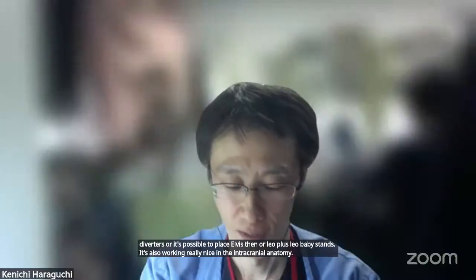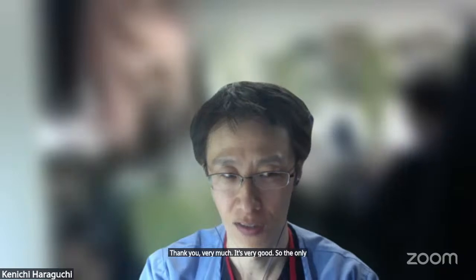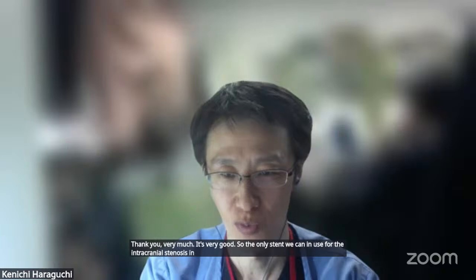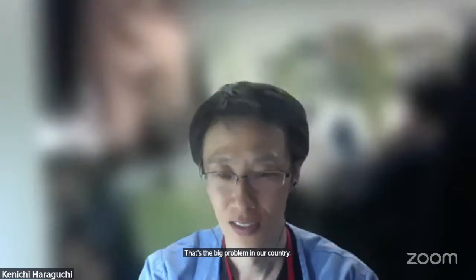Thank you very much. So the only stent we can use for intracranial stenosis in Japan is Wingspan. That's the big problem in our country. Yes, it's a problem of registration.